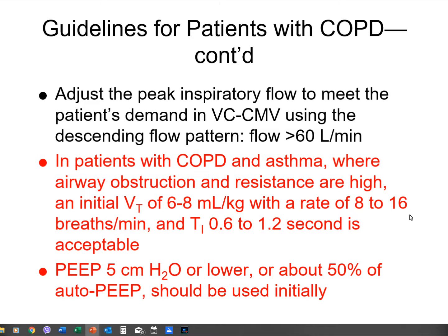If I have my respiratory rate high, I blow off the CO2, I pretty much knock out their breathing, then I'm going to kill the patient. So watch your respiratory rate, but make sure your tidal volume still stays at 6 to 8. That's why I don't really like 8 to 16. That 16 might be pretty high. We want to make sure that we don't blow off a lot of CO2.